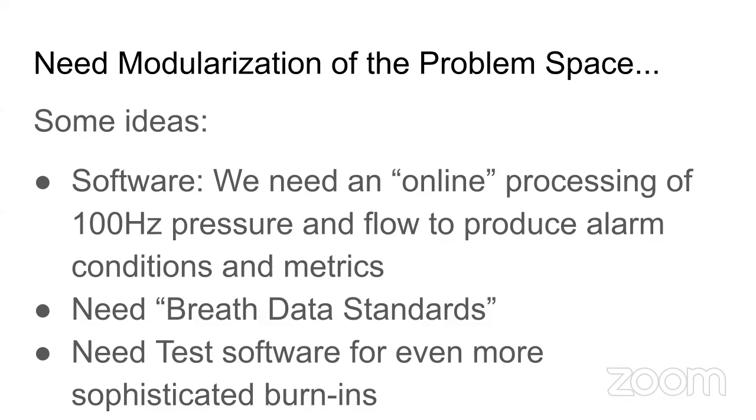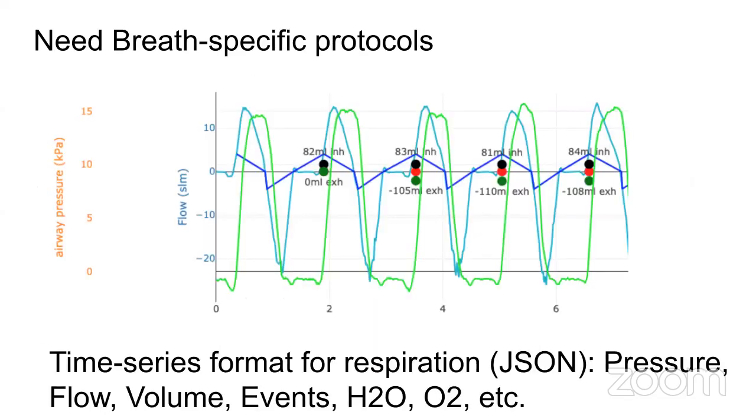From a software point of view, we need online algorithms on the Arduino, but I use online in the old community sense, not as on the internet: an algorithm which can process data as it comes in, 100 times a second, processing a new pressure and flow sample. And the nice thing about this domain is you really don't have to sample more than 100 hertz, I think. You don't have to deal with enormous quantities of data. But we need breath standards. And we also need test software for sophisticated burn-ins.